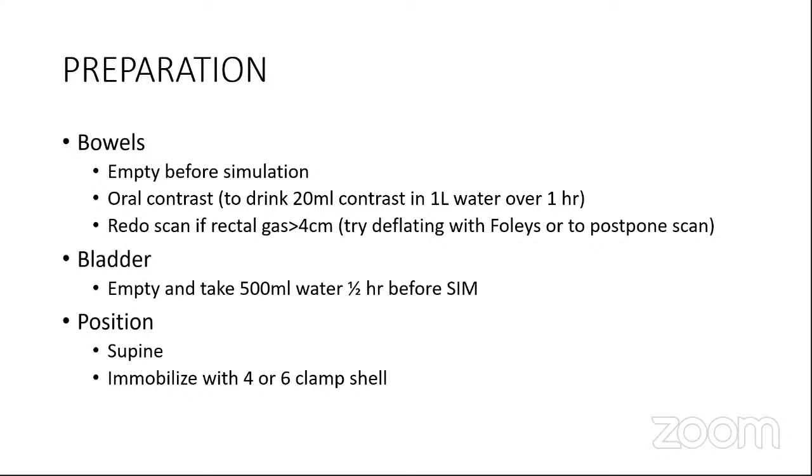But let's just stick to the principles of all this. So how do we prepare? What are the problems with a CT scan or planning in a cervical carcinoma? The cervix is right between the bladder and rectum, both of which are going to vary in volume every day. So we need to find some ways of standardizing the rectum inside the pelvis during the time of external beam radiation. So that would be the best way. So how to standardize that?